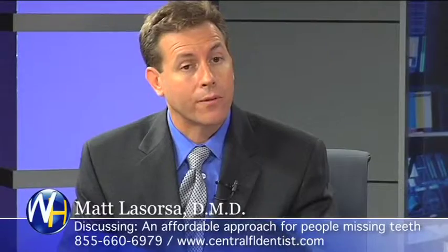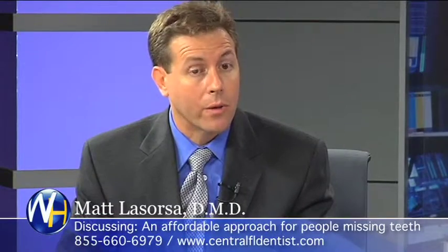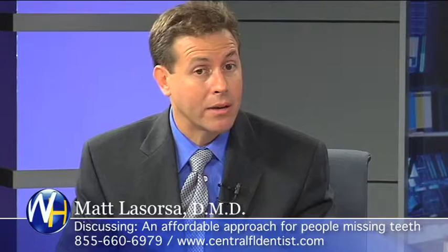How many for fixed? Somebody wants a fixed set of teeth, how many dental implants for that? You're saying for mini implants. They don't want something that comes in and out, which I'm surprised to learn, that with mini implants you could give somebody a fixed set. If we're going to use mini implants for it, I'd say 8 to 10.